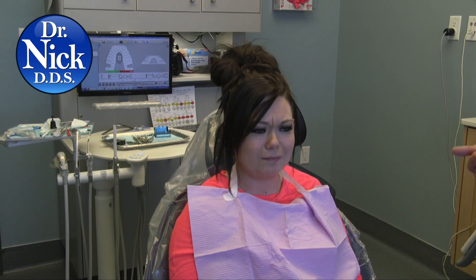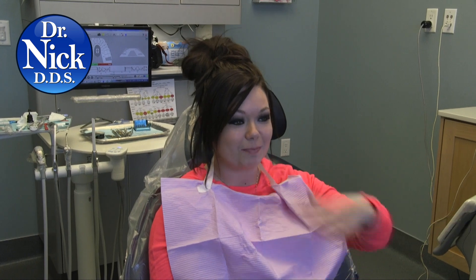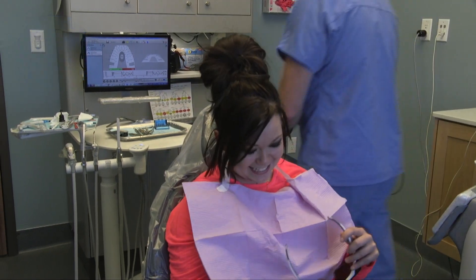Nothing at all — no local anesthetic. Would you rather have it the old way with drills and shots, or this way? This way for sure, because now I can go back to work, back to my day without having a droopy face. Pretty cool, right? Awesome.